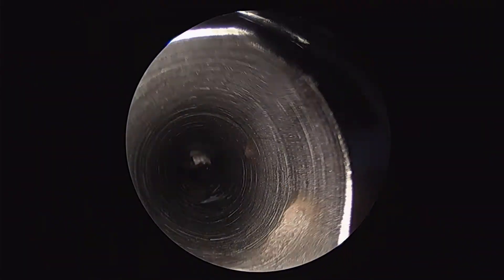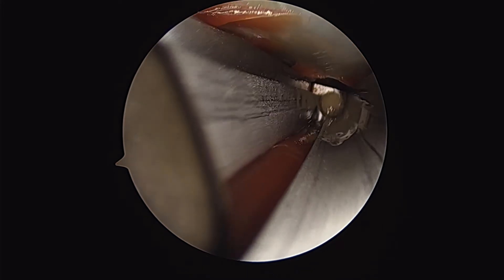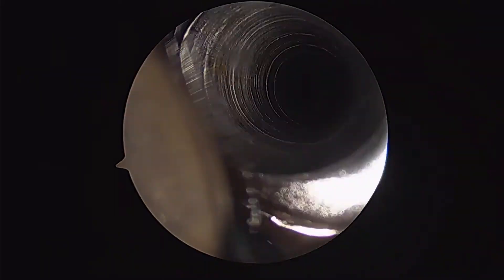So it allows me to do a very minimally invasive fasciotomy without having to worry about the blind tips of my scissors encountering any muscle or straying off of the fascia itself. And it gives me a great deal of security when releasing this fascia through a minimally invasive technique.